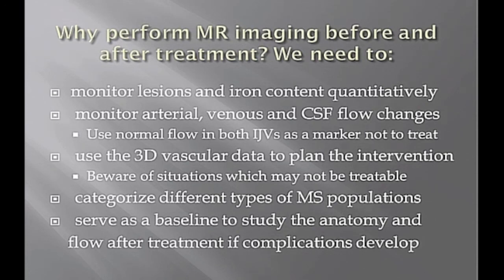And hopefully, in all the work that's done in these first 3 talks, we hope to characterize the different types of MS populations by having this quantitative data. And of course, for the patient, this is a baseline scan for them. If they develop restenosis and you've not had an MR scan for them, what are they going to compare to? They have nothing to compare to.